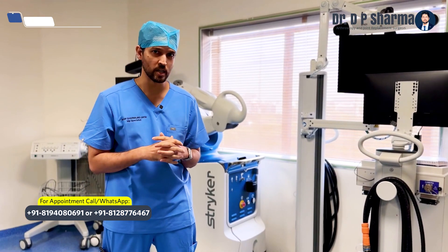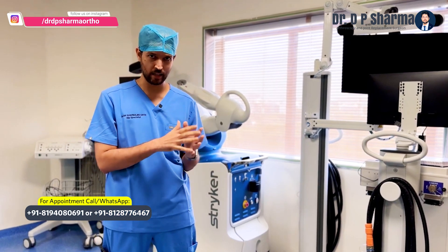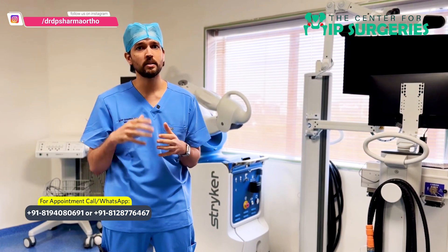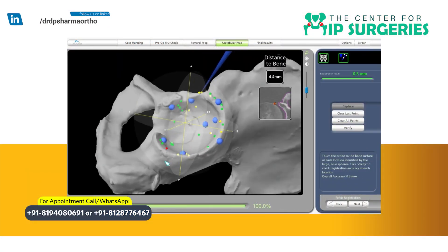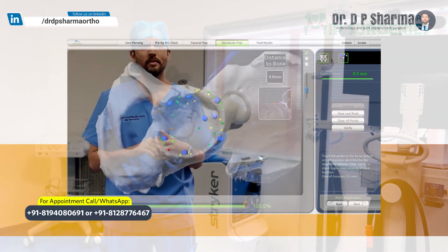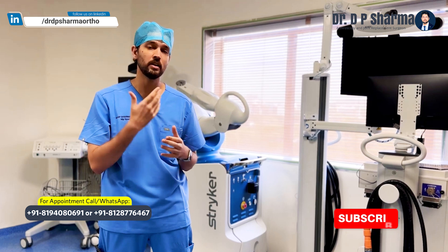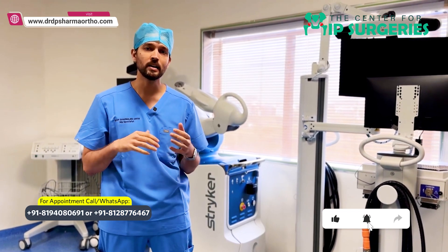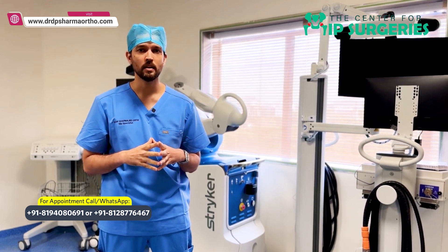Now we will be starting the DAB technique — Direct Anterior Robotic Bikini technique. The incision will be the same, but the cup and the stem will be placed with the help of the robot. This is a new era of hip replacement, and we think it is going to change the way we used to look at hips — it is important in posterior approach where version is critical, and in complex hips as well. Thank you so much; if you have any doubts you can contact us. Have a nice day.